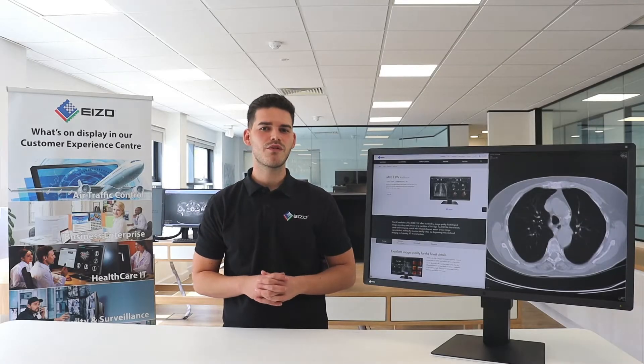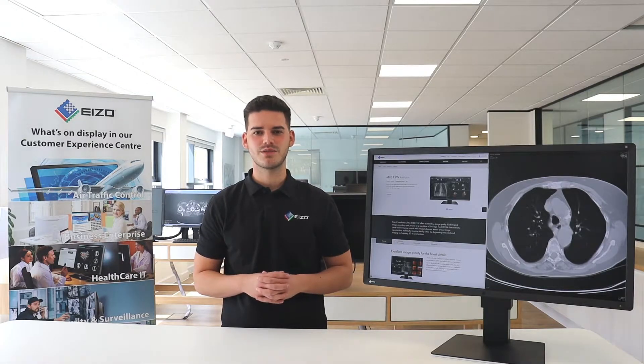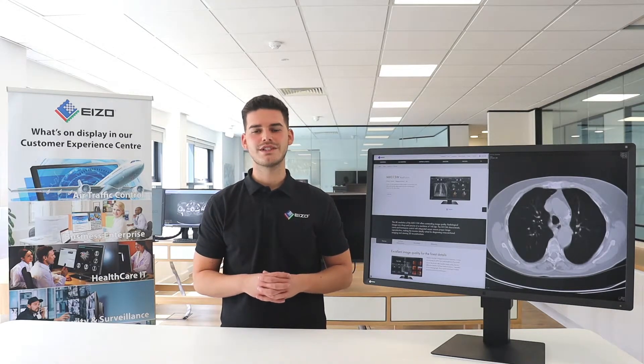The MX315 is a 31.1 inch medical monitor with an 8MP resolution — that's 4096 by 2160 pixels — the highest in the Radiforce MX series of clinical review monitors. It has DICOM part 14 calibration support and can display a variety of medical images at the same time, including CT, MR and ultrasound.